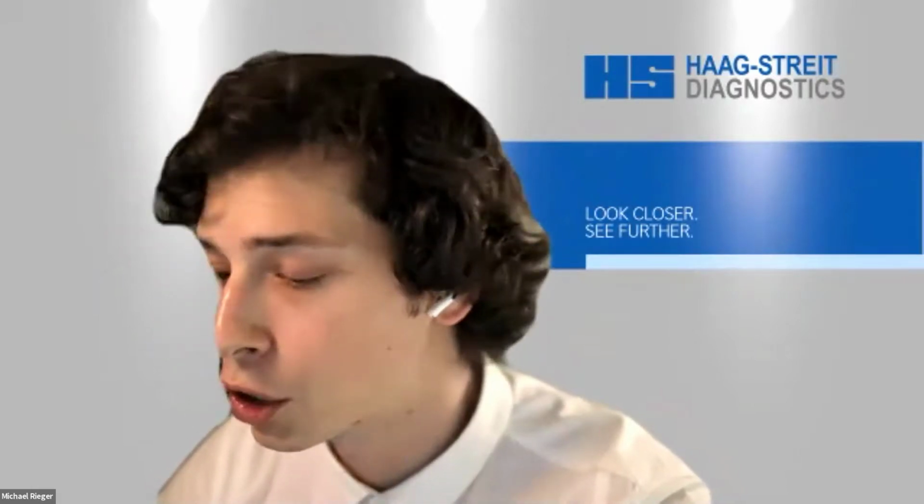Just to mention, I did not go into details about our formulas and IOL calculation in general, because there is a following webinar, which is called the Practical Approach to IOL Calculation, on the 21st of May. So I did not want to cover this topic as well. This is something which is coming up, and of course, you're welcome to join this webinar.